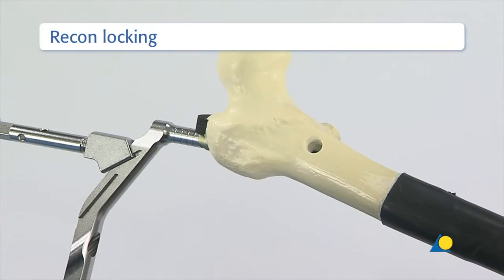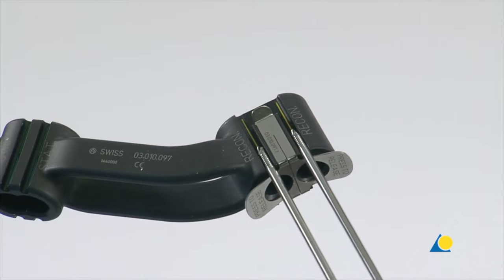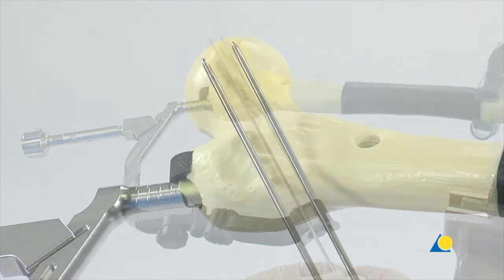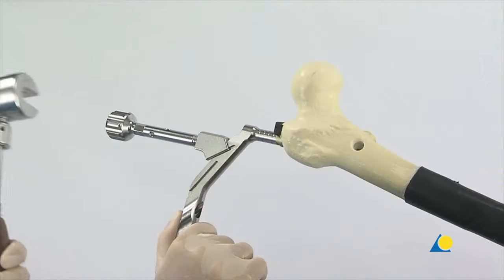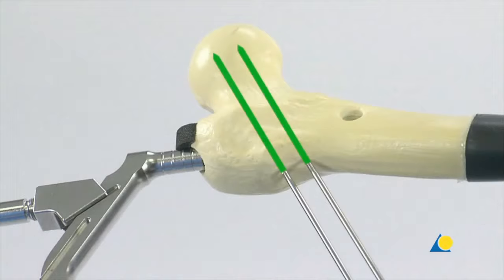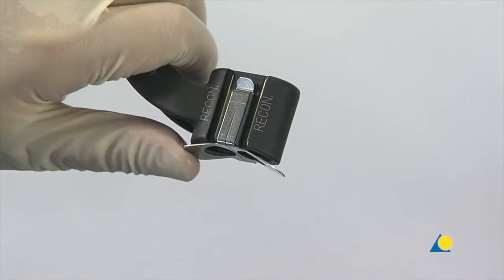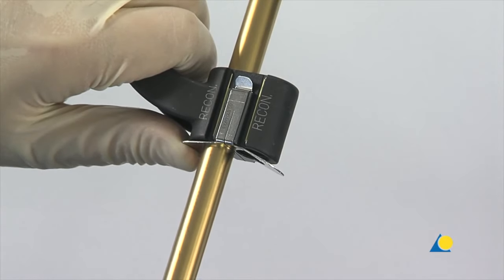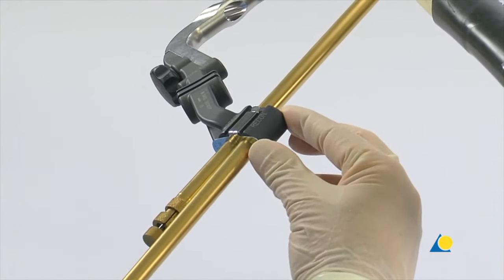For the recon option, the nail has already been inserted and the aiming device has been mounted. Two guide wires are placed on the slots of the aiming device to check the depth of the nail insertion so that two hip screws can be inserted within the femoral neck. The distal wire should be near the inferior cortex of the femoral neck or there would be no room for the proximal hip screw. If the depth of the nail needs to be adjusted, the connector is reapplied and the nail is advanced with gentle hammer blows until the required depth is reached. The connector is then removed. A three-part trocar combination is inserted through both yellow colour-coded holes in the aiming arm labelled recon and advanced through stab incisions to the bone. Releasing the clip-on holds the trocar combination in place.